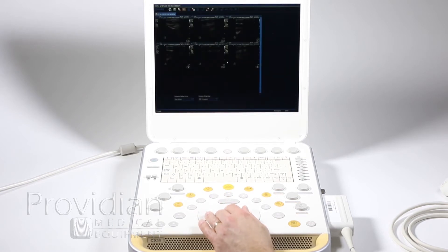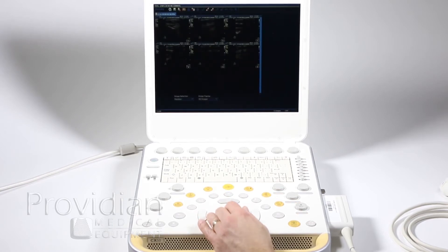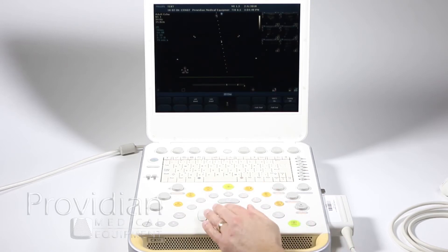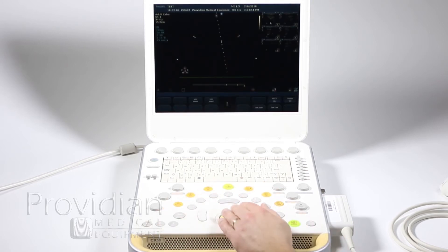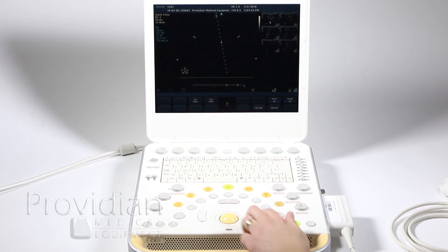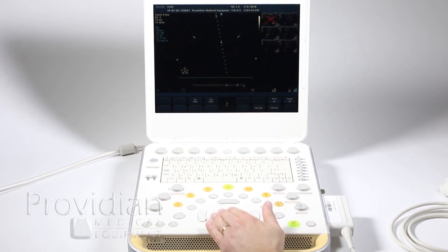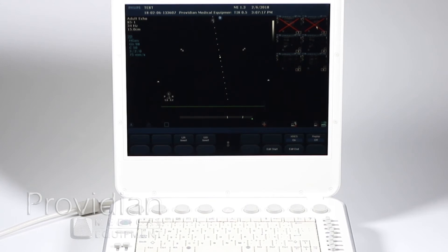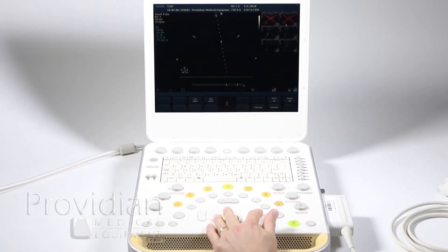We'll go back and deselect them all, and then you can get your image review right there. I'm going to go back to 2D and show you how to get to that in a different way. One other thing that wasn't covered is you can right-click on it and it'll give you an X, so it'll show those images on there and it won't delete them until after you end the patient, so you can't accidentally delete an image while you're scanning.